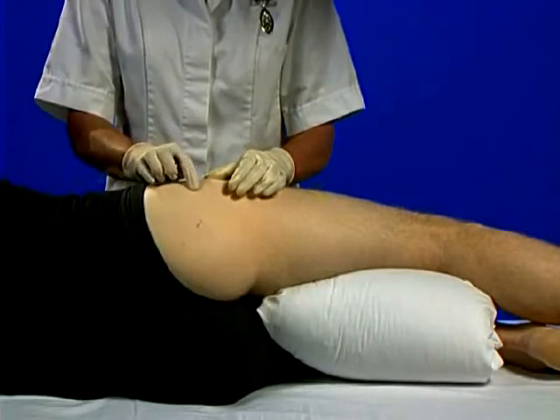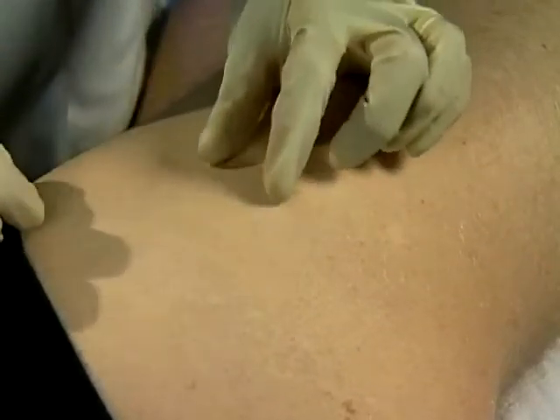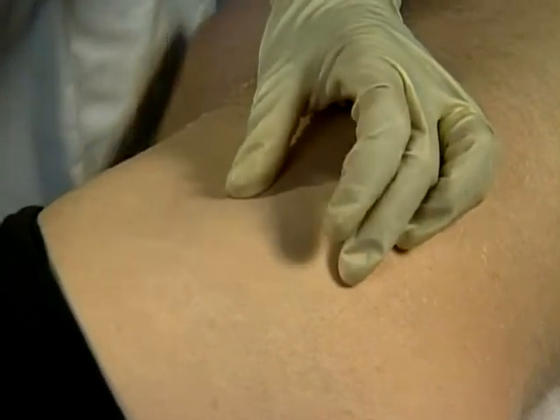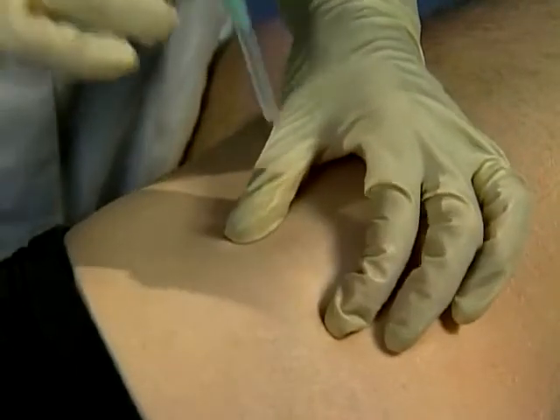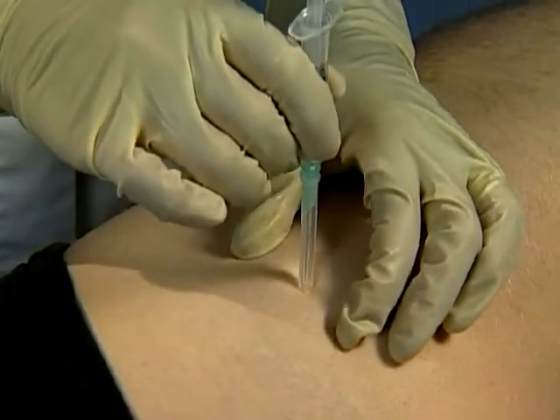Identify the epicenter of the tender area on the greater trochanter. Mark your entry point here, clean and firmly stretch skin. Rapidly insert needle perpendicularly to gently touch bone. Withdraw slightly, aspirate and inject as a bolus.